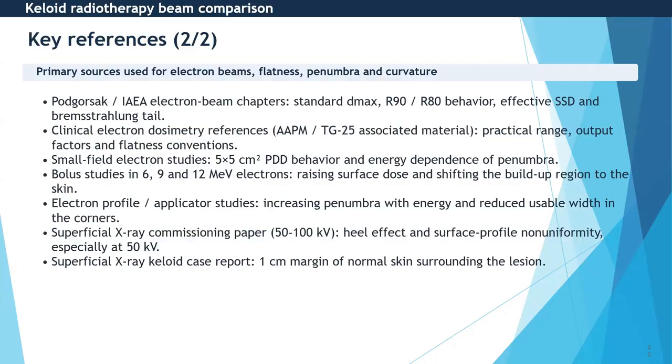My question is, I know in your presentation you said the electron dose will fall off sharply with depth. In my practice, one of my radiotherapy department physicians told me there is also some radiation in the deep layer of the body.